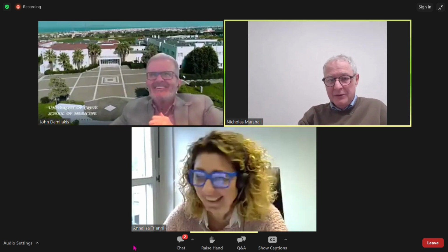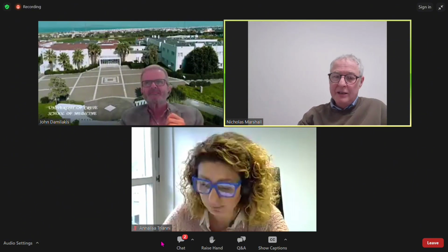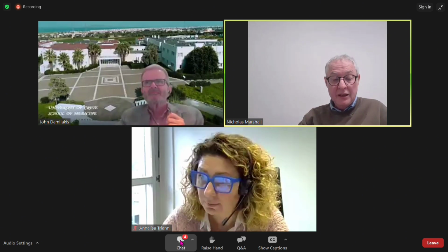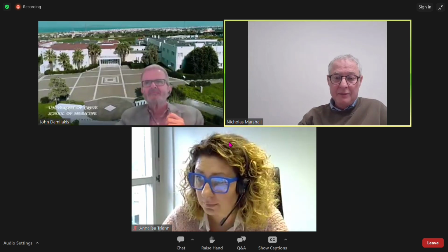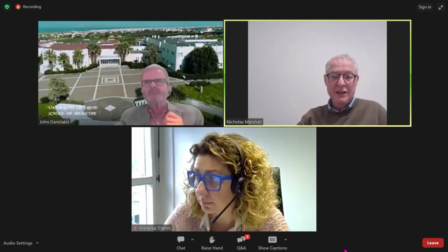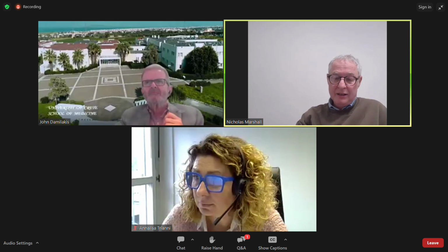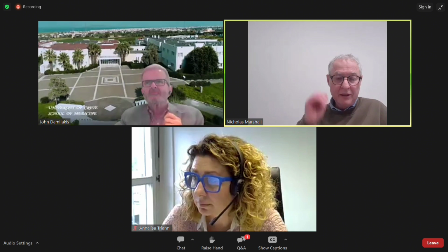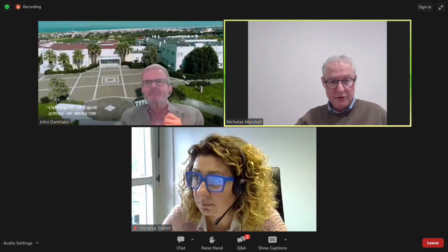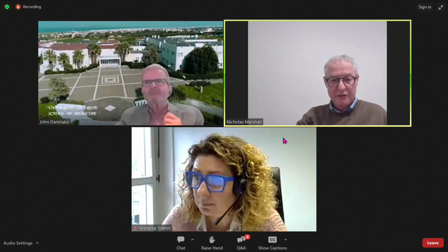It's a dream. I mean, you would expect that if you change aspects of the system, let's say the energy or the dose rate, and you change the noise and the contrast in the image, the task performance would change in some way. I don't expect it to be linear. It's a very hard question. You'll be able to set the system up where you won't be able to do your tasks. You might have too low a kV, with no penetration through the patient. It'll be too noisy. Your task performance will be awful.